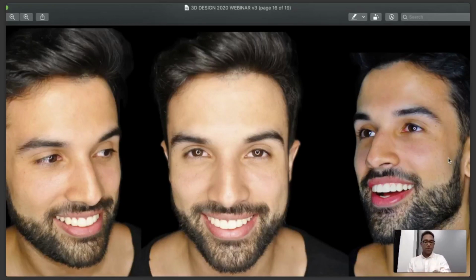For the mock-up, we did a mock-up on him. We used the bisacryl, and we did not use immediate provisionals. We did composite veneers, so everything was done in one time. We used the mock-up, we minimally prepped the patient's mouth, and then we did the composite veneers right on top of it.